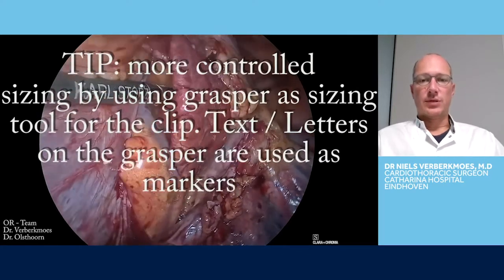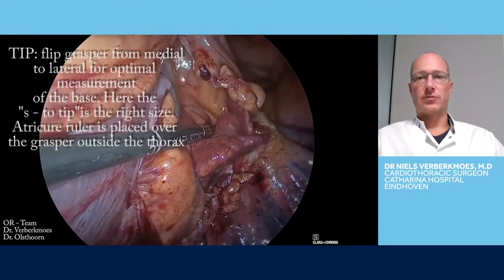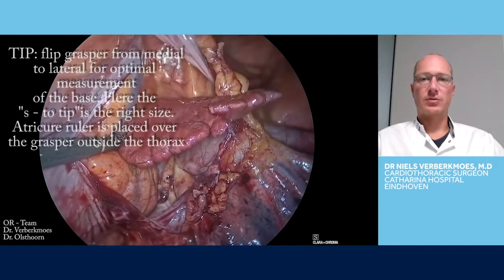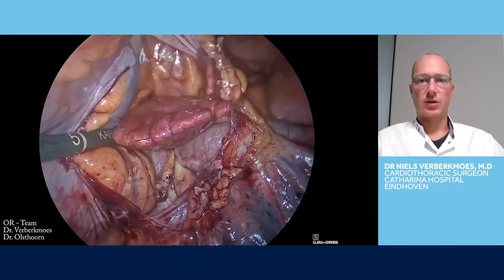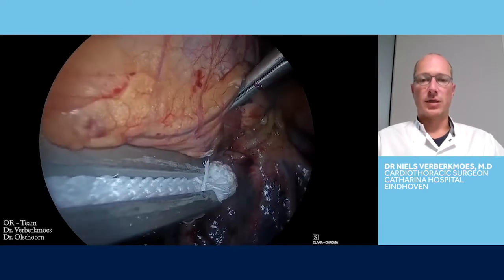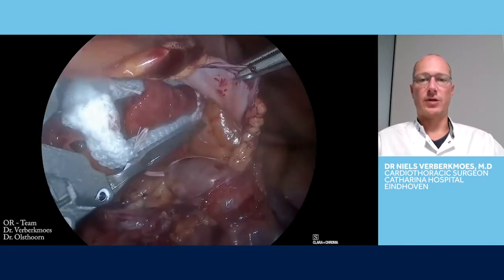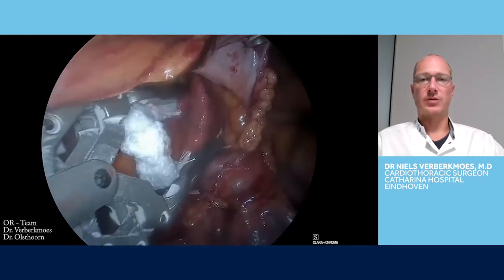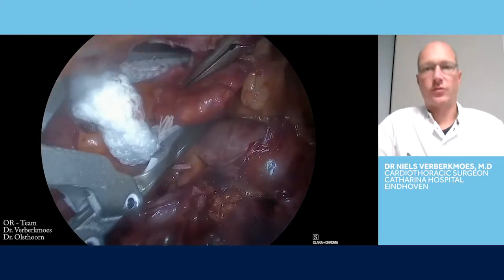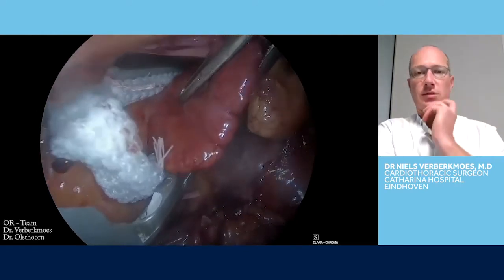And in the end, we make an amputation of the left atrial appendage for multiple reasons. The most important reason is to exclude the left atrial appendage from the electrical activity of the heart. There are some indications that the clot formation and the risk of stroke is lower with closing the left atrial appendage, but that's another discussion. It's not important for this specific talk and presentation.